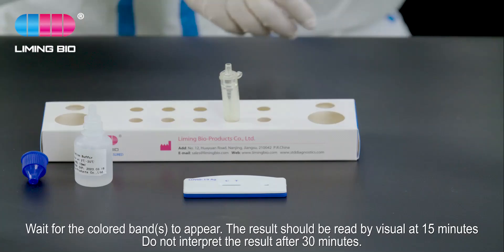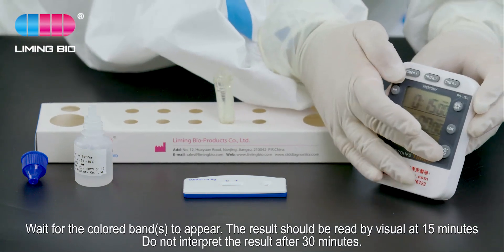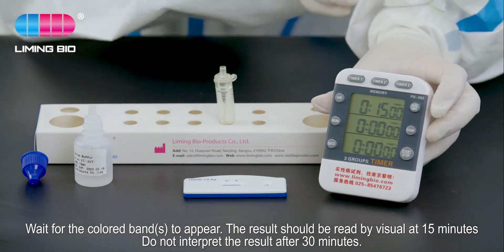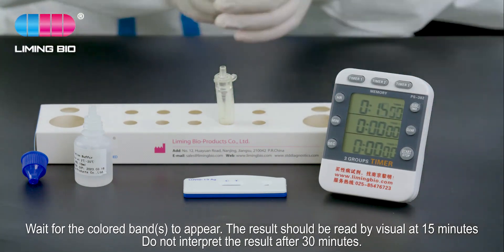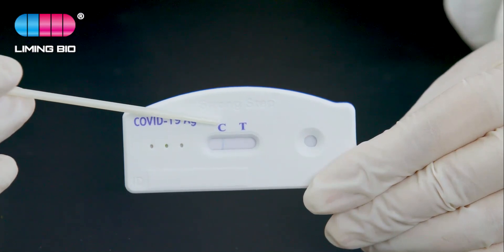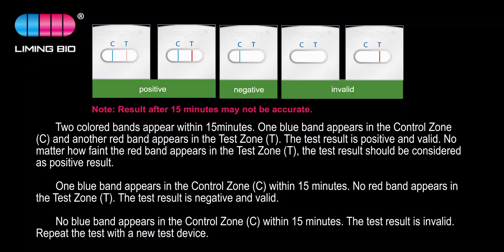Add three drops (approximately 100 microliters) of extracted sample from the extraction tube to the round sample well on the test device. Wait for the colored bands to appear. The results should be read visually at 15 minutes. Do not interpret the results after 30 minutes.